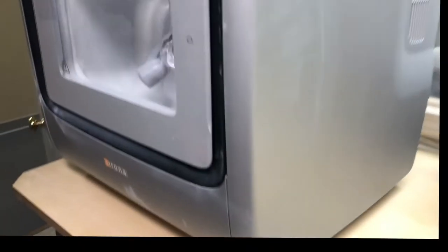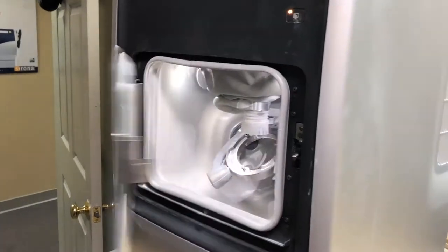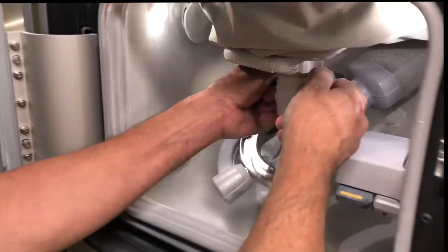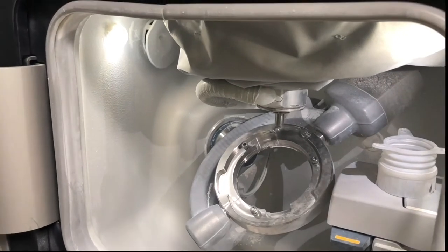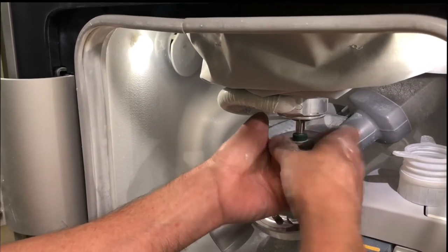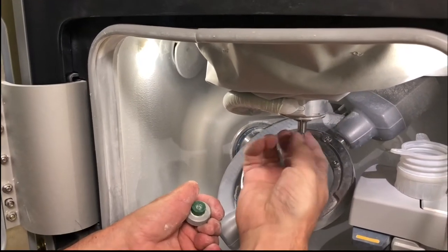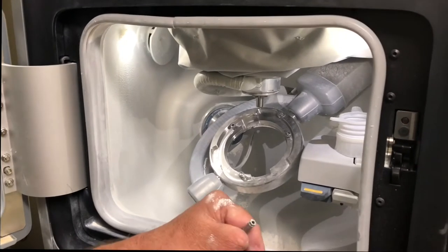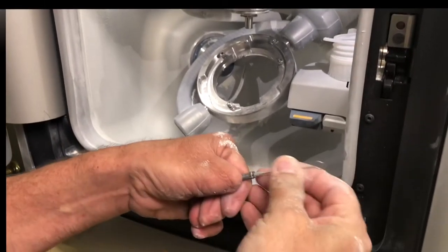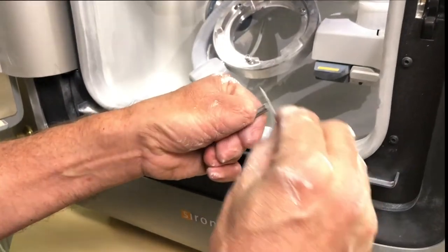We're at the X5 that we're going to be doing the spindle maintenance on. You can see my spindle maintenance kit. We'll open the door. We have to remove this cover here — very easy. We will unscrew the spindle. We will use this instrument here to clean the inside really well.